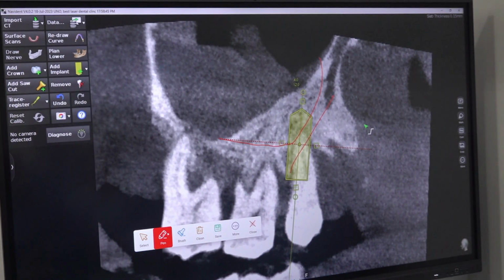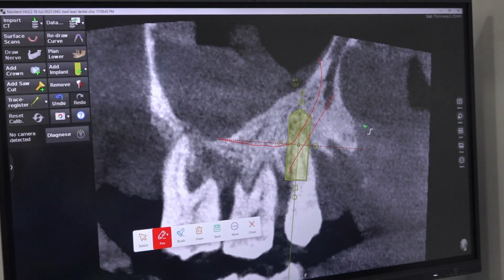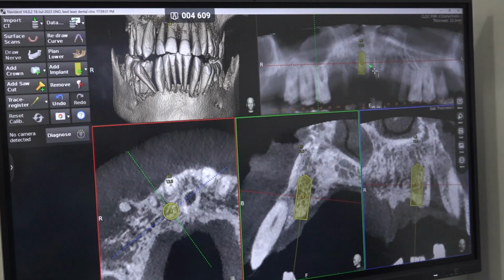Okay. So anyhow, we are not going to. So all the palatal sockets of 6, 7, 8 are good, so we can use any of them. The only thing is the bleeding, a lot of dilation of tissue. So on the right side, we are now coming to the 1-1 area.